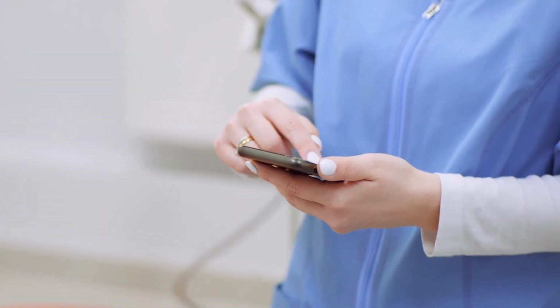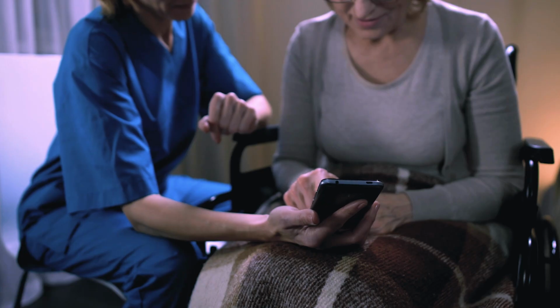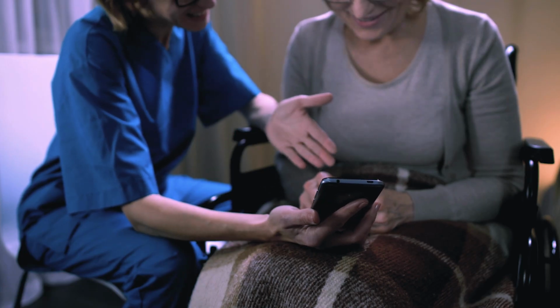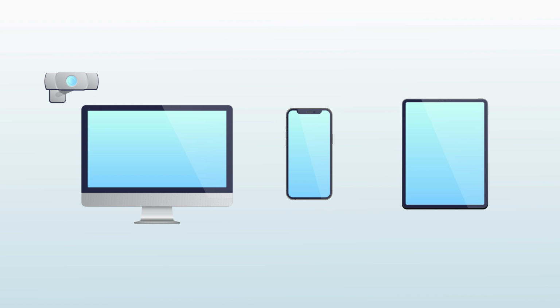Vitacam is medical software developed for healthcare professionals as well as home users under their guidance to gather, report, and review vital signs data. The system utilizes standard digital cameras such as webcams and smartphone cameras to measure a person's respiratory rate, pulse, and heart rhythm optically.